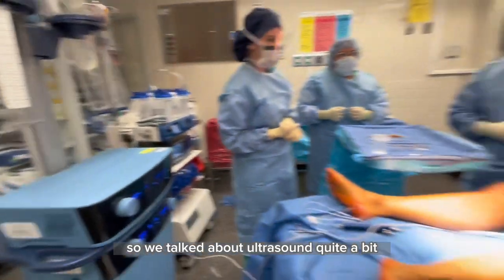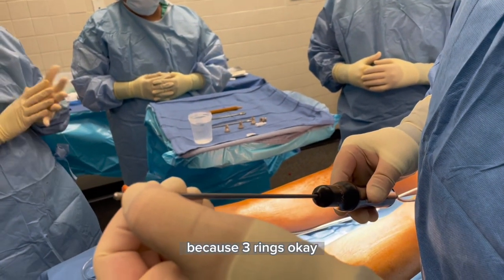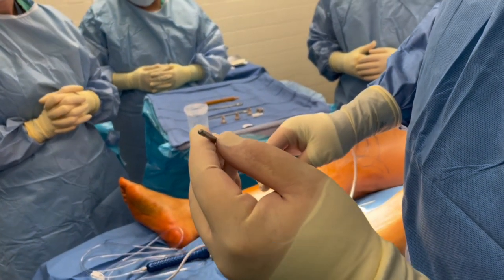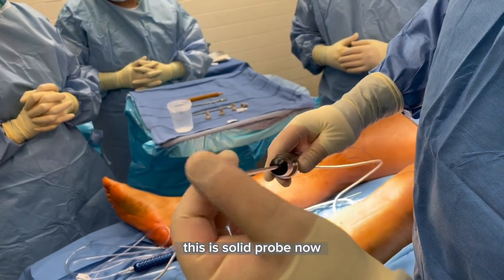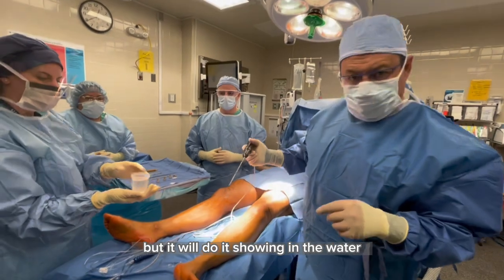We've talked about ultrasound quite a bit. I wanted to look at the tip here — you see it has three rings. It's not a cannula, so it cannot suck anything out. This is a solid probe. It's kind of hard to show you what it does in the body, but it will demonstrate in the water.